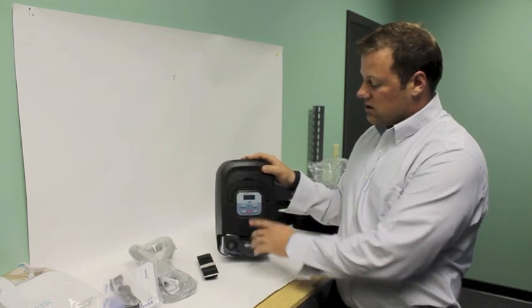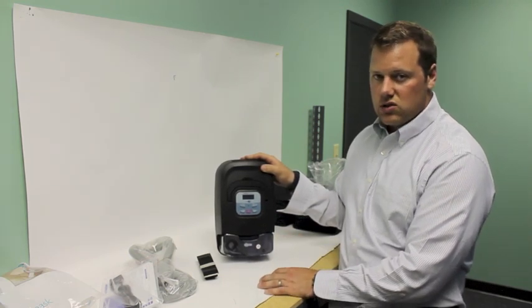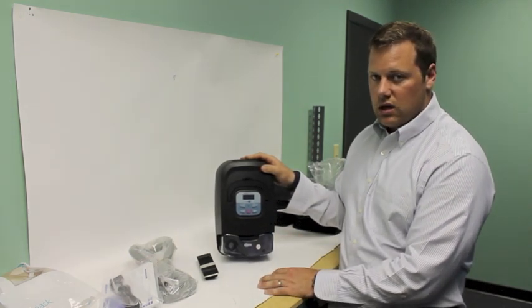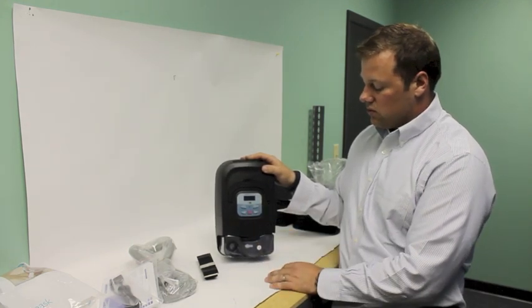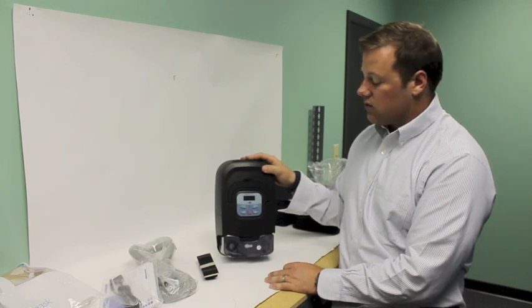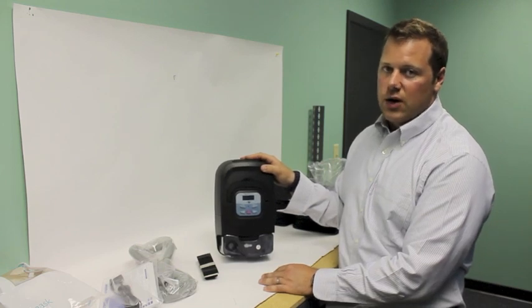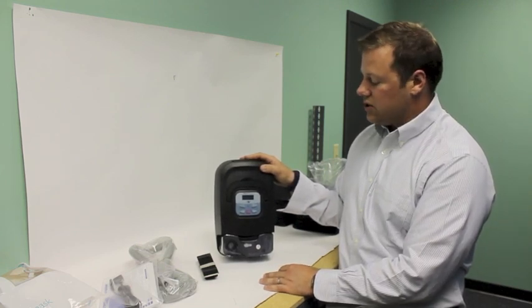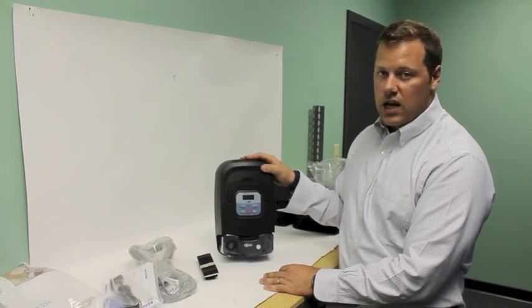The keys and the buttons aren't as easy or don't have the big screen like the RESmart does, but it's still just moving things back and forth. You can flip through to the different screens in order to make the adjustments, or whatever adjustments your provider has basically allowed you the capabilities to adjust. So like the ramp and then the humidification.